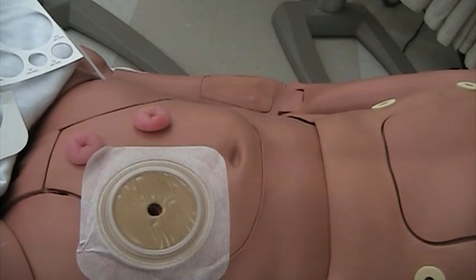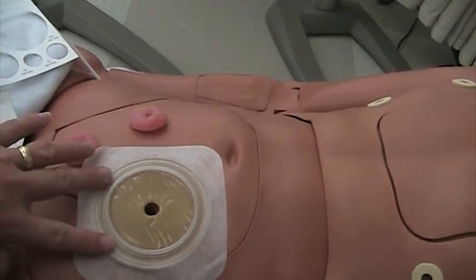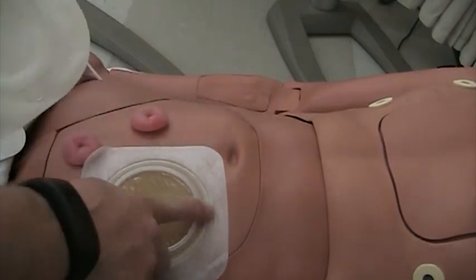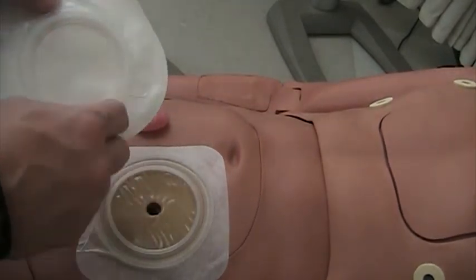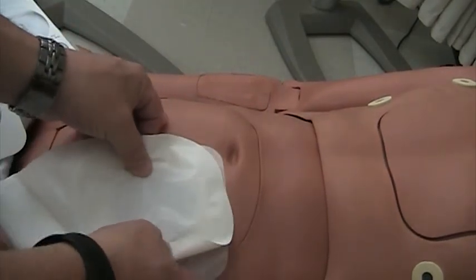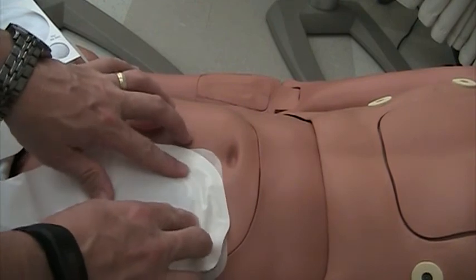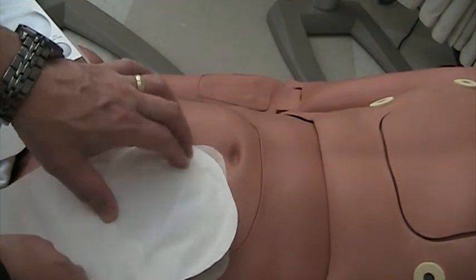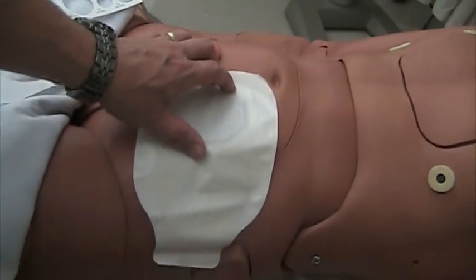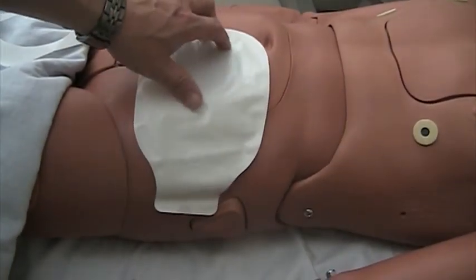Okay, the next part of putting on an ostomy is the bag. Bags come in different sizes, and it's based on, this particular one is Convatec here, this wafer, and you want a ring that fits over that ring, the female adapter over the male. So it fits here, okay, it pushes in, and then you have the bag. Now this bag could be tilted here, turning to the side, however the patient's comfortable.